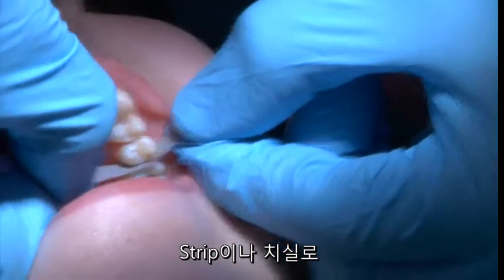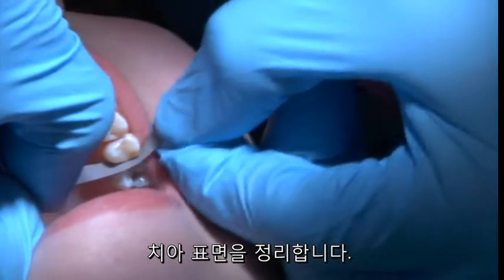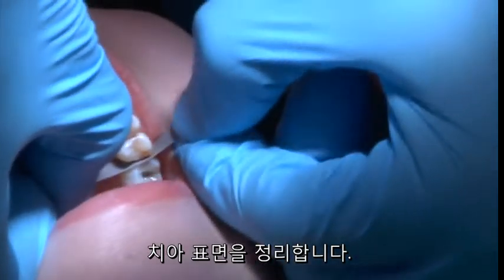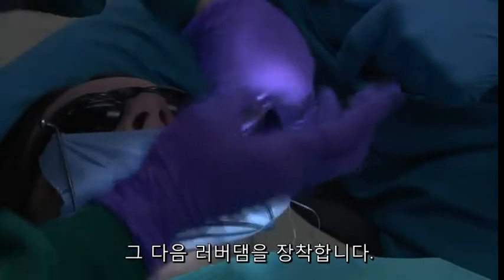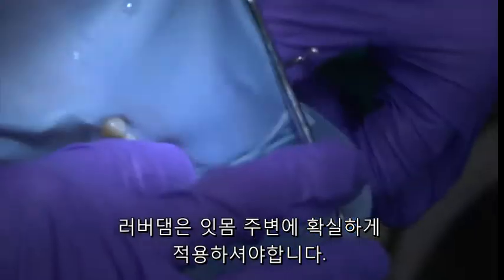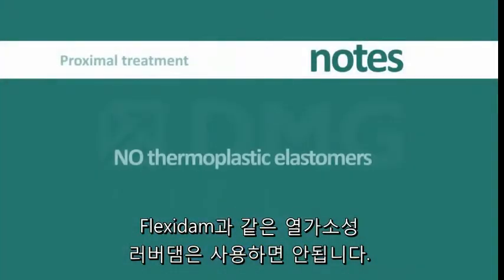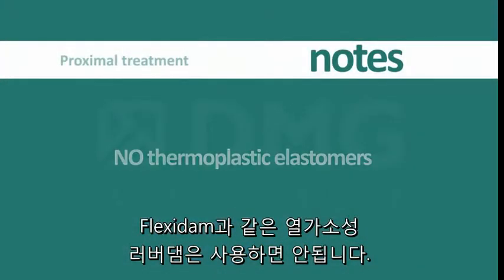Prior to treatment of a proximal lesion, the treatment site should be cleaned with dental floss and/or dental tape. Then isolate it with a rubber dam. The rubber dam should be well adapted and inverted at the gingival area. Do not use rubber dams made from thermoplastic elastomer such as flexi dam.